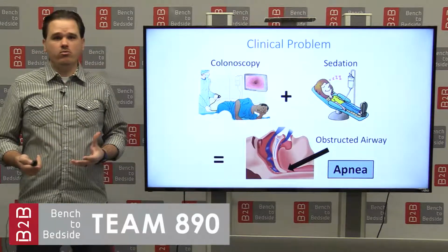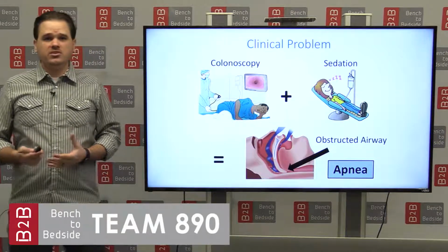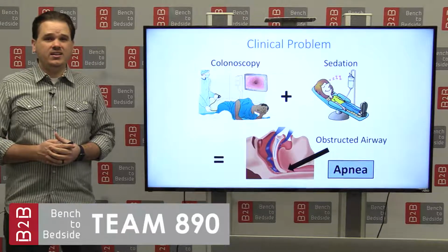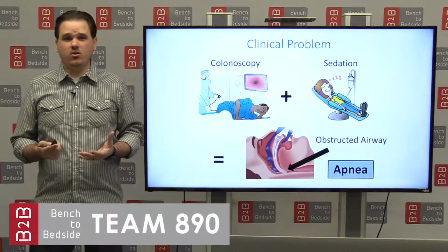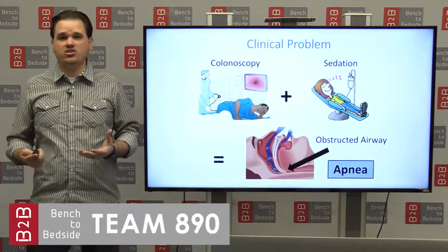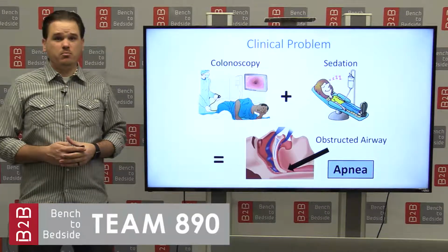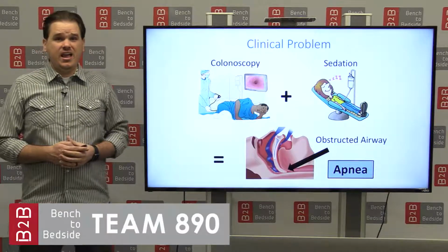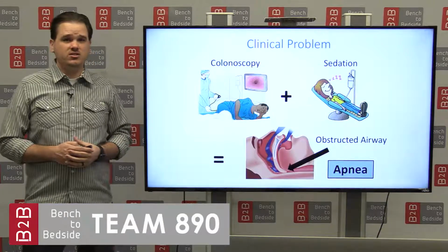So when they go in for a routine colonoscopy and are sedated, they may stop breathing multiple times during the procedure. I have personally collected clinical data that shows that the average patient stops breathing 7 to 10 times during a colonoscopy. This is because the current standard of care is to simply provide oxygen through a nasal cannula or loose-fitting mask. Oxygen provided this way does little to no good if the patient isn't breathing. And currently nothing is done to detect or prevent obstructive apnea during these procedures.